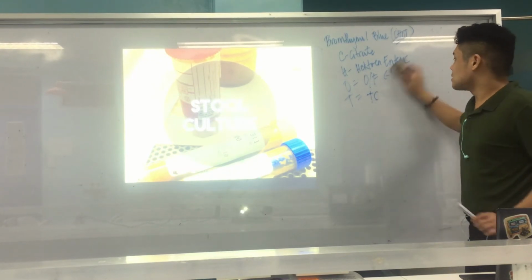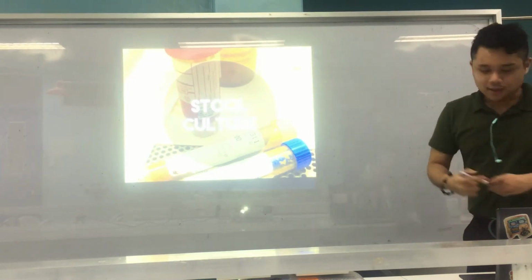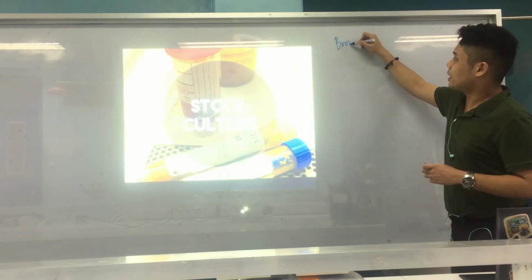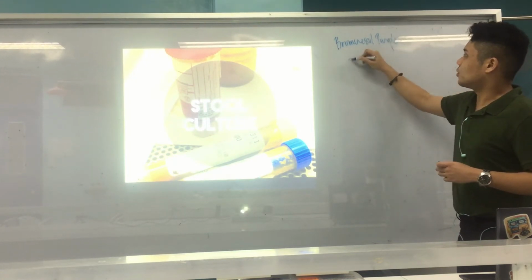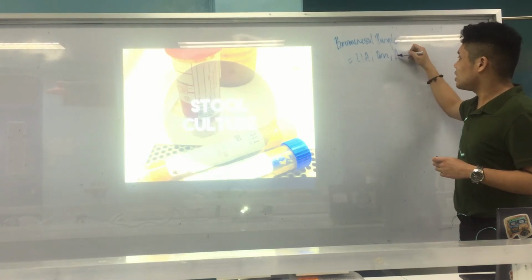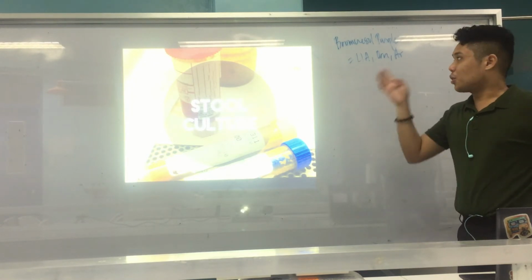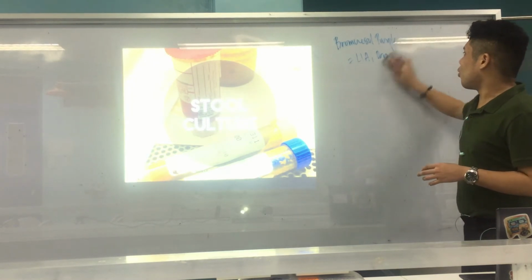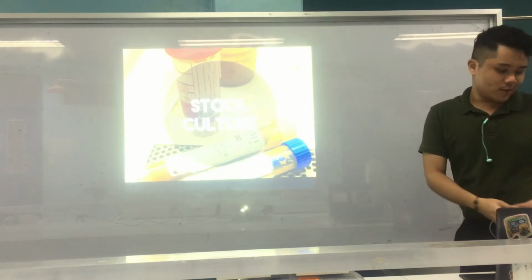The last indicator is bromcresol purple. You have LIA, and the ornithine and arginine tests, which are usually decarboxylation tests using bromcresol purple. Those are just some mnemonics.